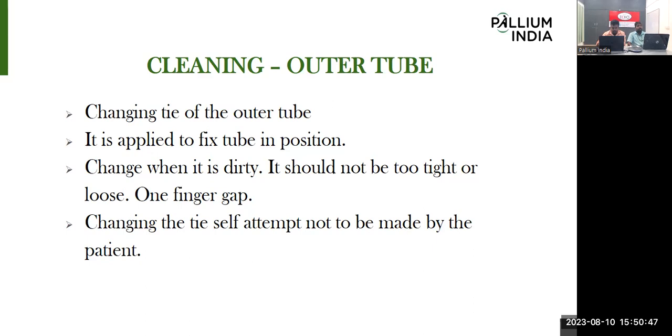If the patient attempts to change the tie, we need to educate them why they should not remove the tie by themselves. That self attempt they can't do. Only the inner tube can be removed and cleaned by the patient.